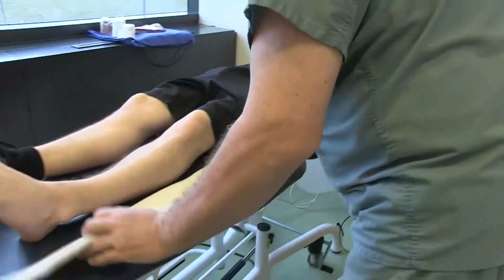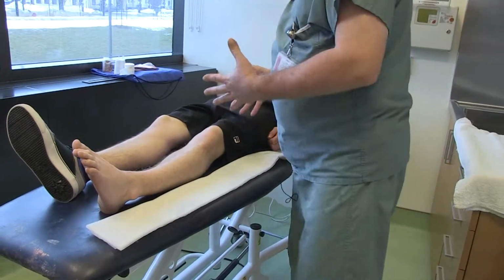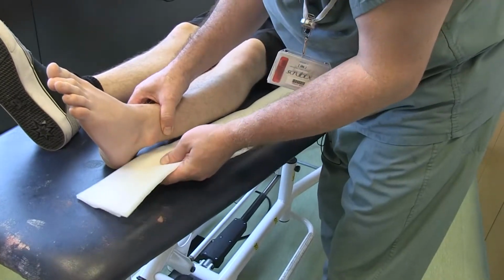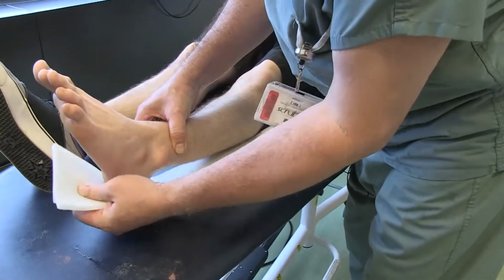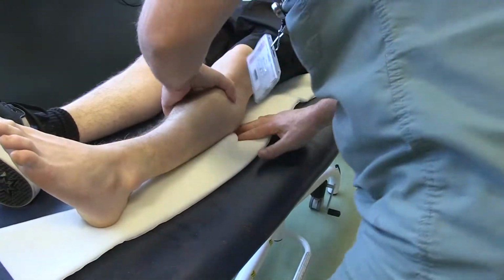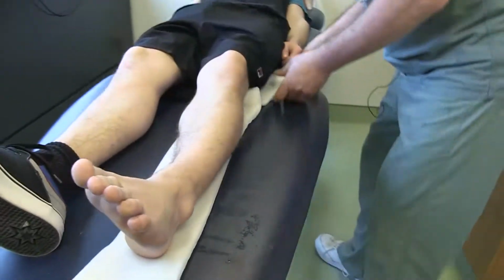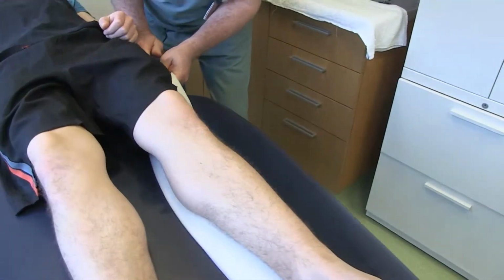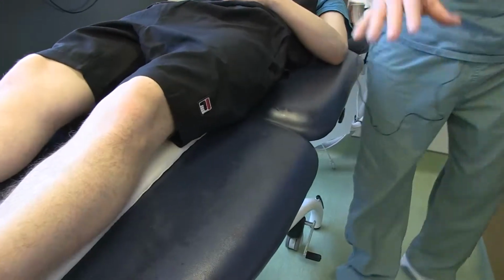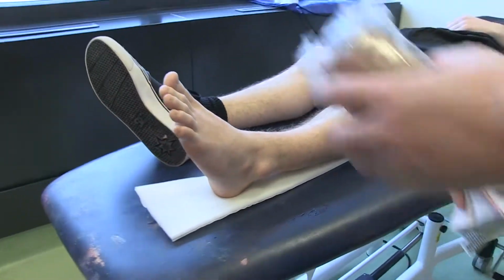Now, when a patient has a fractured femur, we have to consider that it will be painful. The moment we will move the patient, they will show pain. So we go slowly. We can even ask the patient for help. And slowly, I insert the brace underneath the patient. All right, then. Let your foot straight. Up to under the buttock. Are you able to turn a little? Now, if we ask the patient to turn, they will be in a lot of pain for sure, but we have no choice. We have to insert the brace underneath the patient.